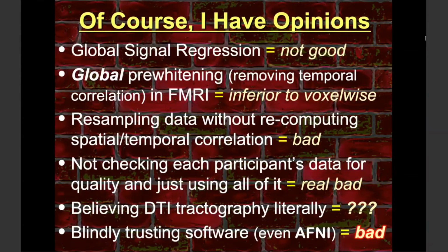And I'll give you another example, a real one, image registration. There was some data I downloaded several years ago from people who are very good, and I have a lot of respect for, and they had used another software program, not AFNI, to register their data to an MNI template. 2% of their data was 60 degrees off, not a little bit off. I mean, I looked at it and went, what the hell? It was supposed to be upright. And I sent them an email and said, you should probably look at this and do this again.